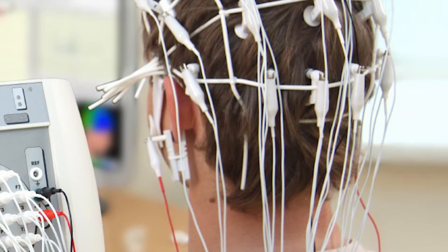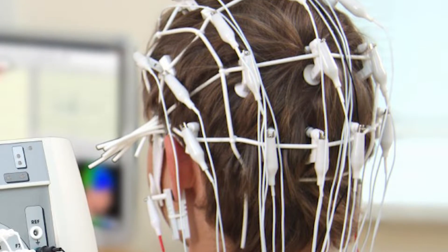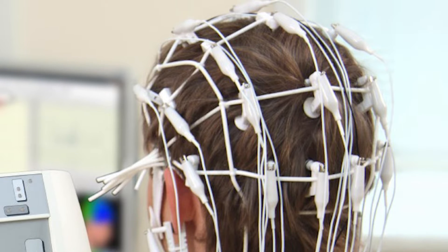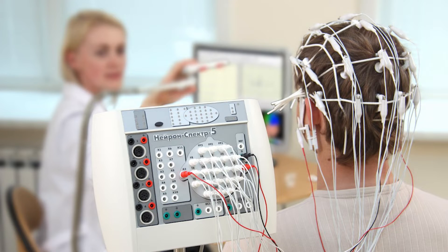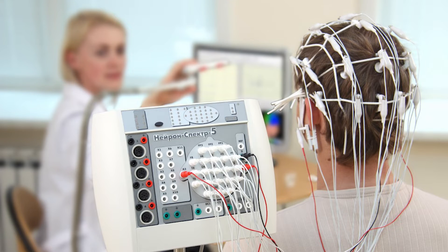An EEG works by gluing many wires to a person's scalp, and the tips of those wires have electrodes which record the electrical signals in the brain.